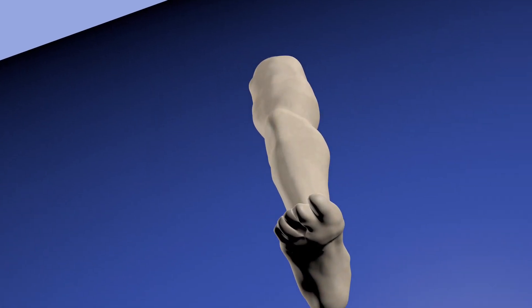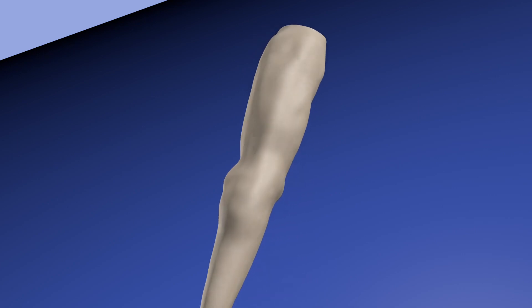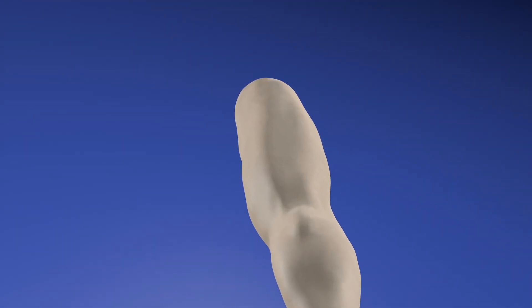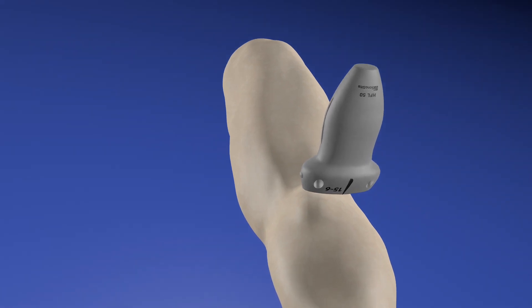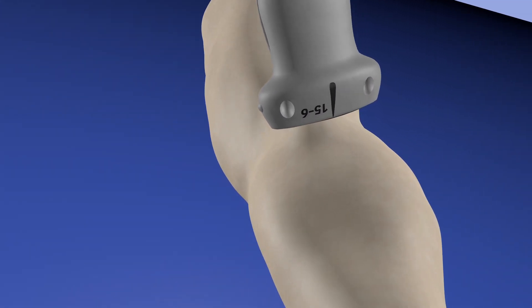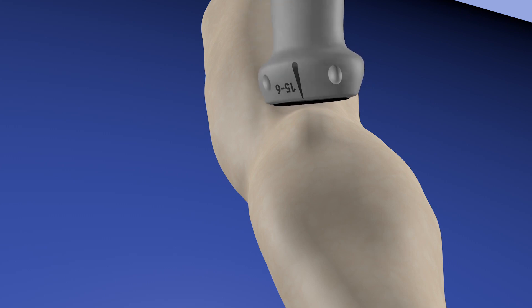Here is our lower extremity. We are going to go through a probe position regarding Baker's cyst. You can see here in the back of the knee that there is a little lump consistent with a pretty large Baker's cyst. We're starting an axial view with our probe, and we want to make sure to go over both the medial and lateral aspects of the Baker's cyst.